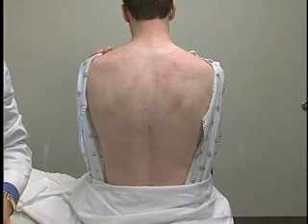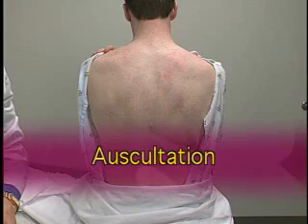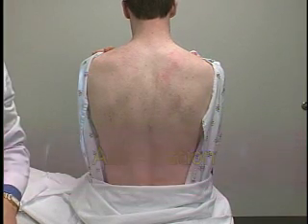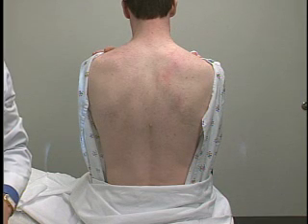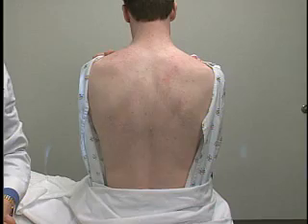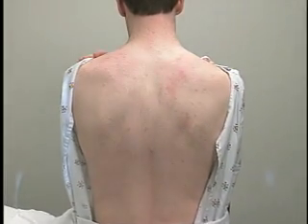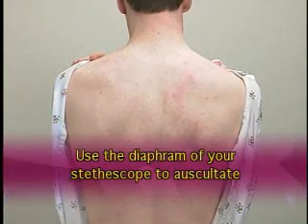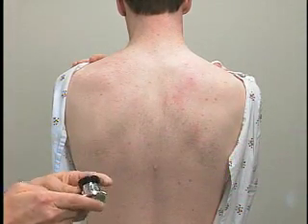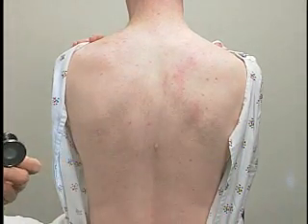The next part of the pulmonary examination that we'll demonstrate is the technique of auscultation. For auscultation, you're going to start at the top of the lungs and compare side to side as you auscultate. You use the diaphragm of your stethoscope rather than the bell to auscultate.